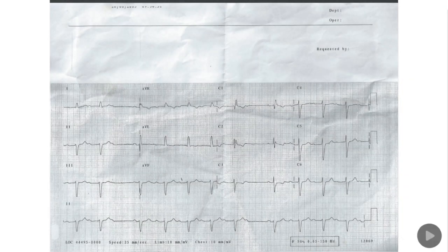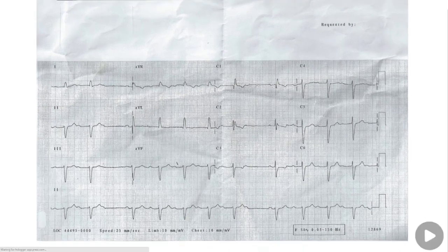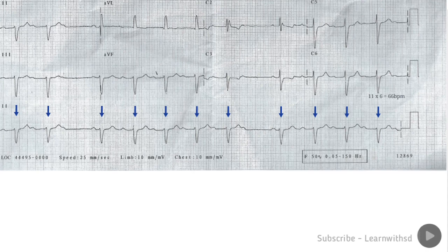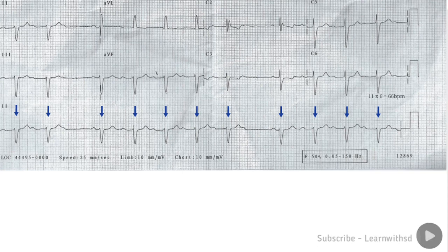This is an ECG recorded from a patient with recurrent episodes of syncope. Heart rate is 66 beats per minute with irregular rhythm. This is showing heart block type 1, or Wenckebach phenomenon. The first conducted P wave PR interval duration is 200 milliseconds or five small squares.